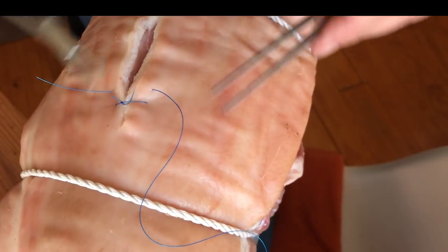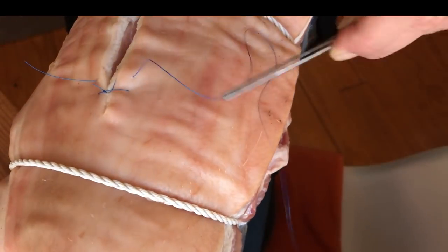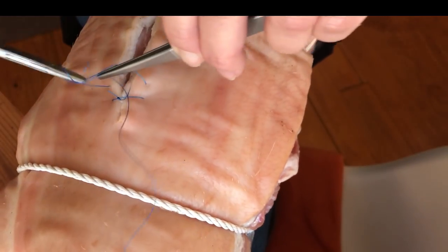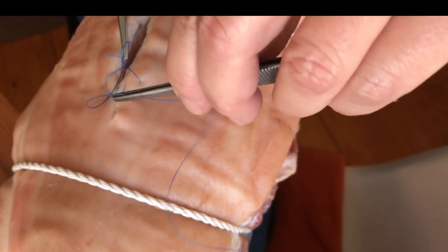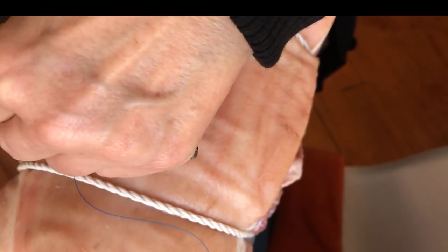Okay, now for that. Okay, they'll explain exactly how to grip this side and how not to grip it and the whole lot and all the mistakes you can make. Okay, this is supposed to come this way. Oh, see, it's one of the mistakes I made. I didn't grip this properly to come this way.